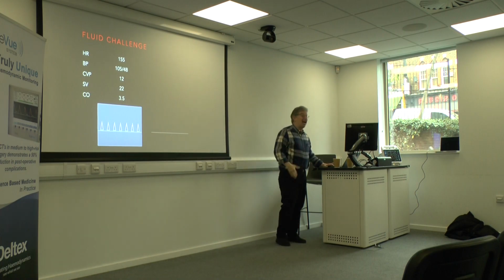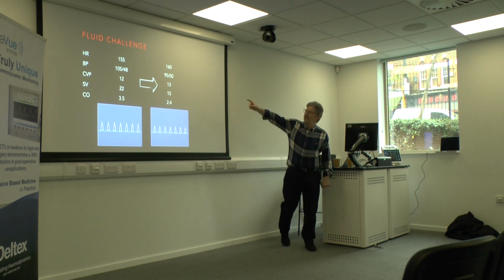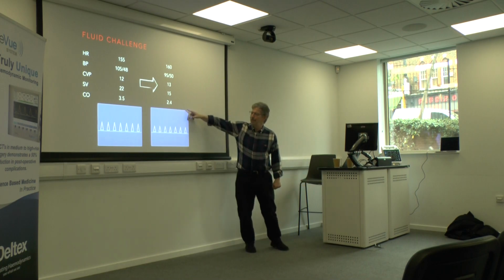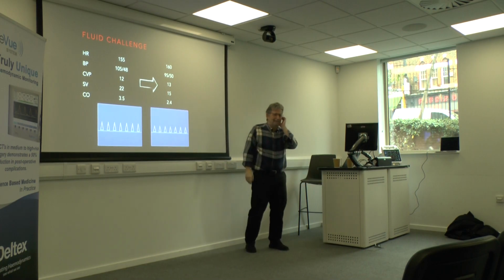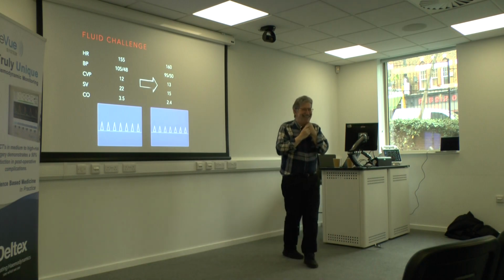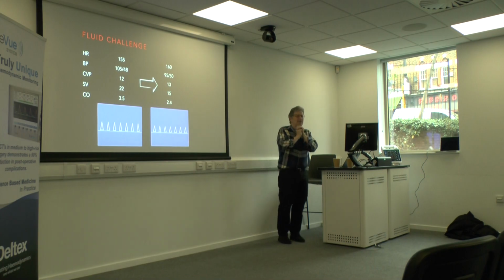Okay, kind of fluid challenge. Result? Yeah. Got worse. So blood pressure was dropping, stroke volume was dropping, cardiac output was dropping. More fluid? No. Hang on, this is 200 mils. The monitoring helped. Okay, so what would you do now?